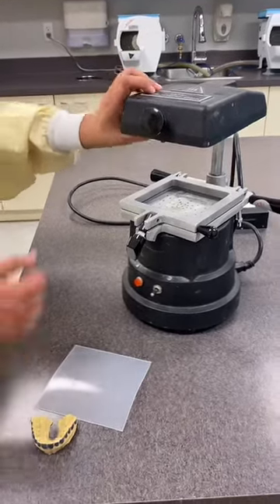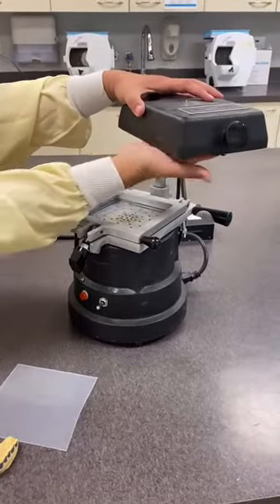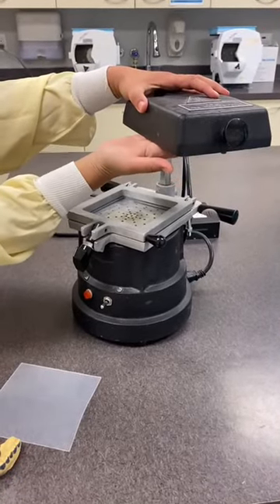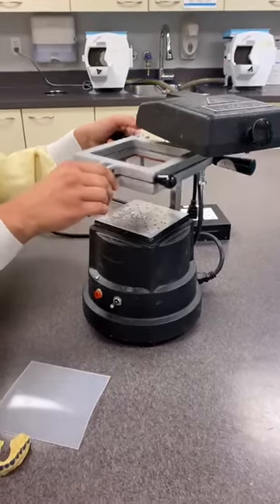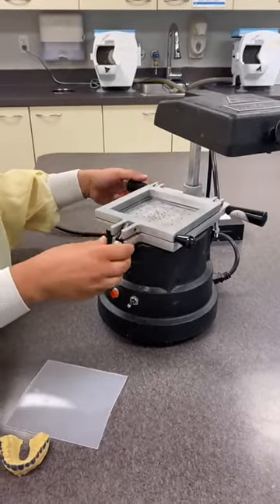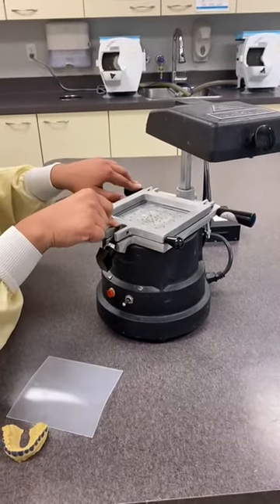This is the vacuformer. As you can see, this part swivels around. There's a heater on the underside of this top part, and this is the frame — it goes smoothly up and down. With this, we get to fabricate mouthguards as well as whitening trays.